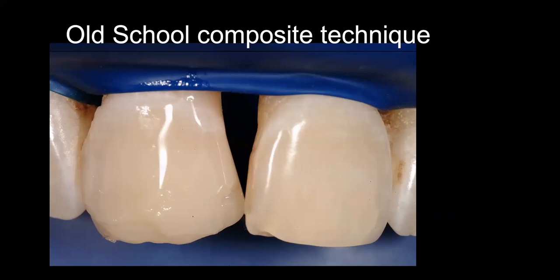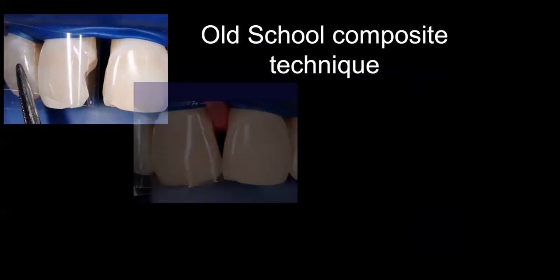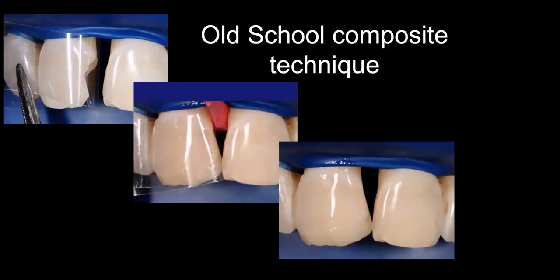This is horrible. And I said, well, margins are the only thing that matters. And this guy says, no, this is ugly, make it go away. And I said, well, I don't have a curved matrix, and I'm supposed to use a wooden wedge. And he said 3 words I'll never forget. I don't care. Make it go away. So I swore to myself that day, 25 years ago, Disha, that I would find a solution for this poor old guy. So when we take a look at the legacy of old concepts, old materials, not thinking about a patient-centered outcome, I thought it was great, and the patient thought it was terrible.